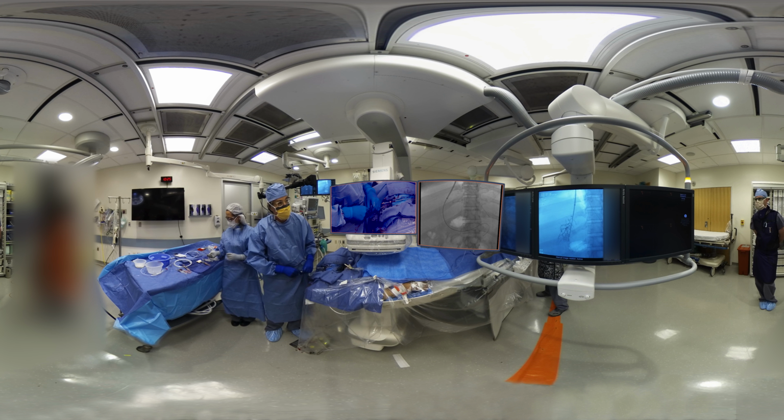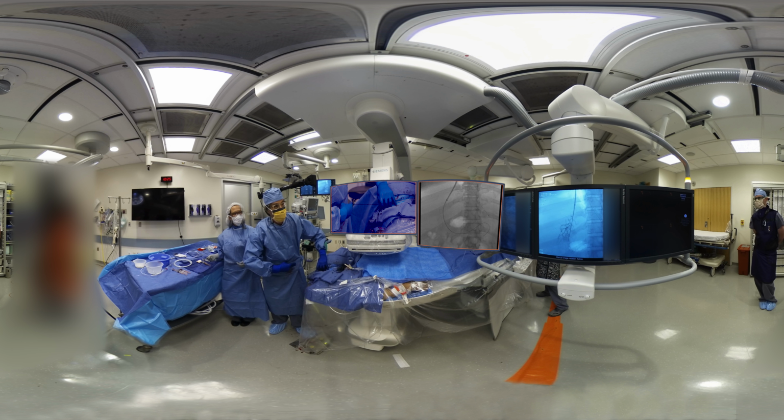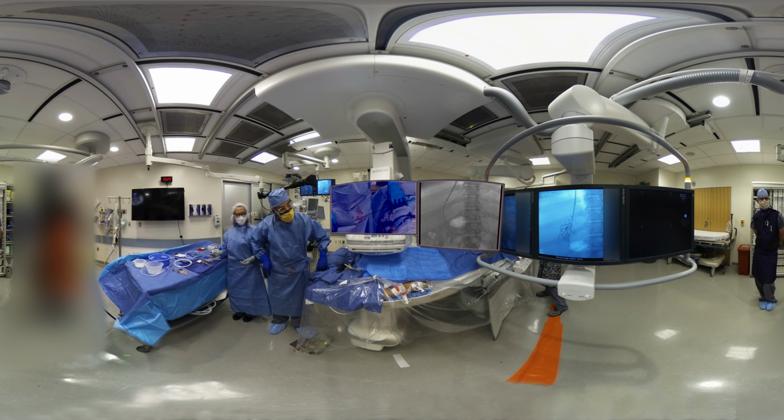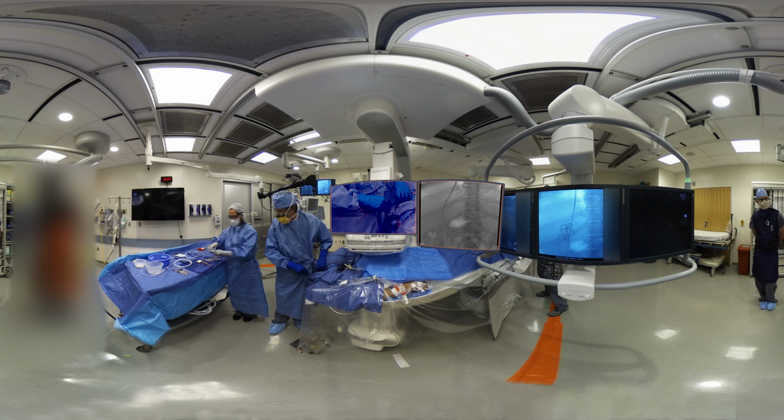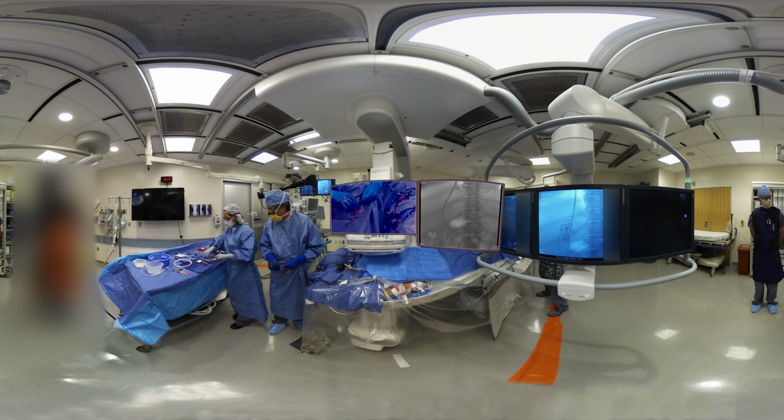So it's very important to maintain good wire control at this point. So I'll mentally assign an acceptable position for the wire, which is, as you see on screen in this case, this very large splenic vein. We're adding a little extra step here. I want to get the sheath into position a little bit further down, and then we'll do our initial splenic venogram. You can choose to do it in the opposite order.